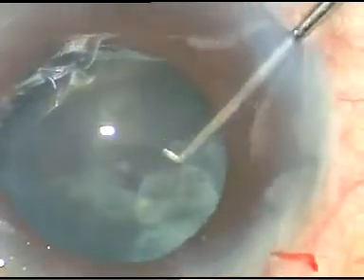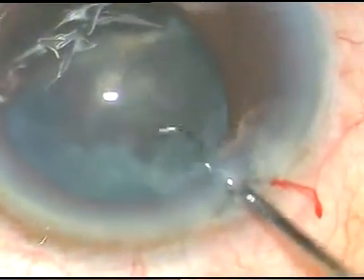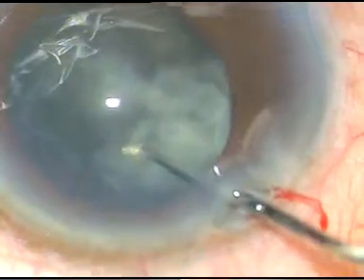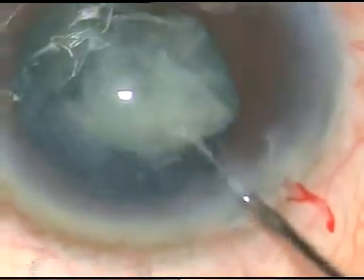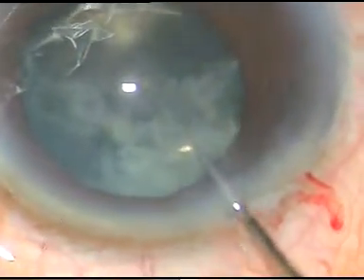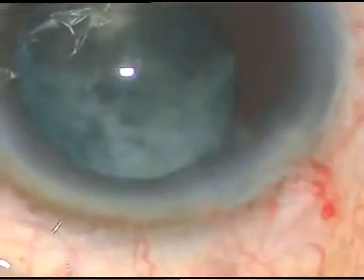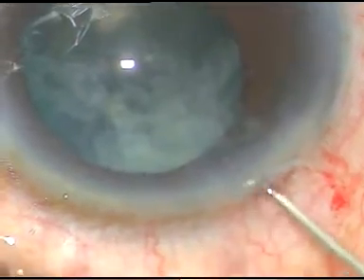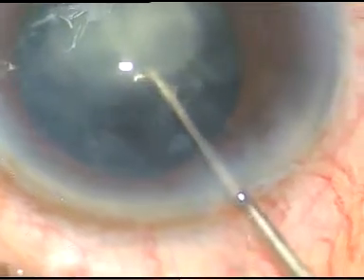Now I try to mobilize this nucleus and I thought it will rotate nicely, but I see that it is not rotating nicely. So I try to elevate this thick sheet of nucleus, try to separate this, and here it is. It tends to go down. So this thick sheet of epinucleus, more than half of it, has given undue pressure on the posterior capsule, and the posterior capsule has ruptured by this undue pressure.